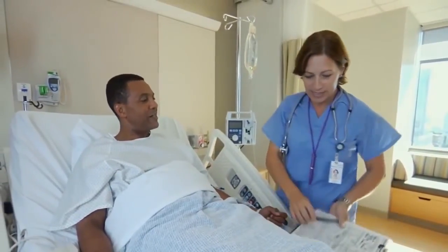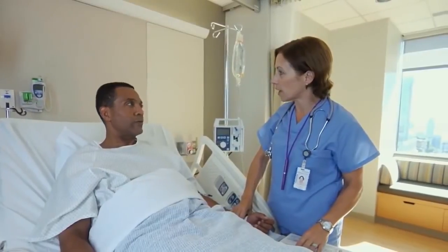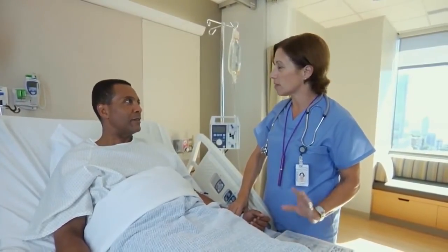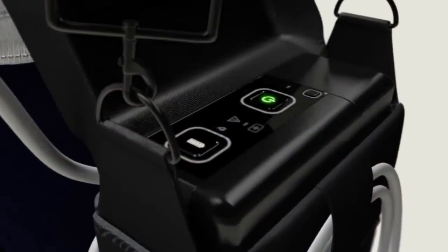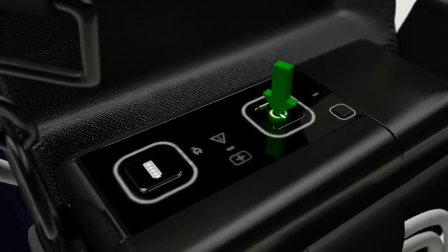After the procedure is completed, the patient may remain in the hospital for as little as four to five days if the procedure is performed in the minimally invasive manner. The patient may easily disconnect from the system for short periods of time, such as for taking showers.